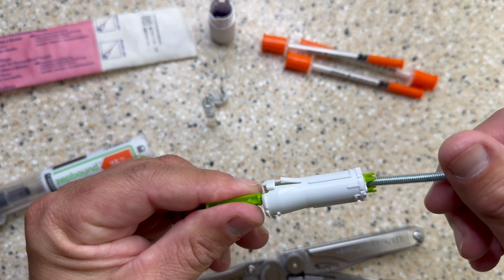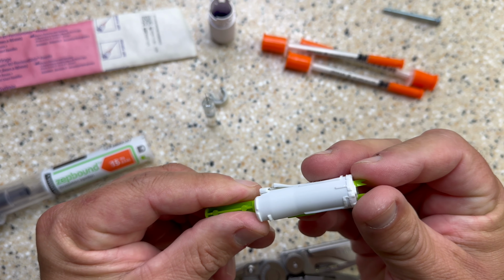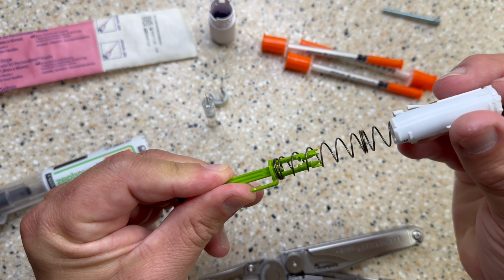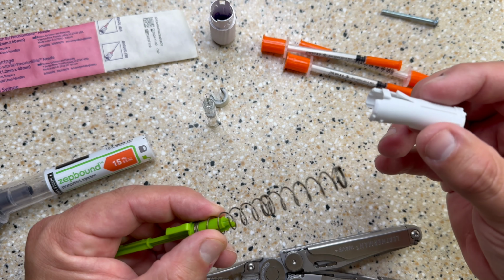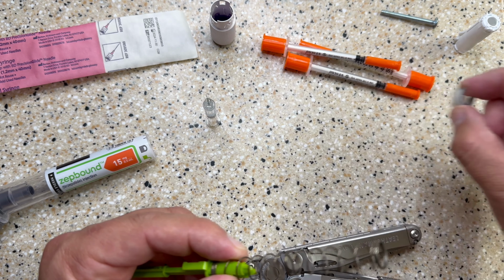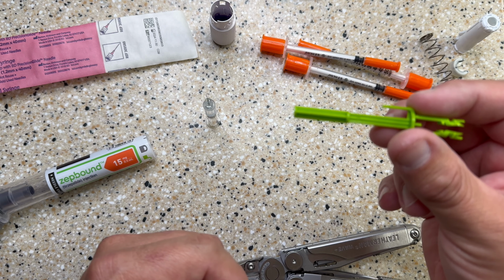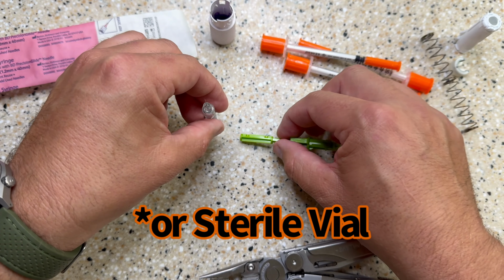I'm just going to show you something a little bit about this. I actually use this plunger in the second part of this process. So what I'm going to do is release it, hold on very tight because this is under a lot of pressure. And that's that. So I throw that in the trash, throw the retainer in the trash, throw the spring in the trash, and then this is what I'm going to use to empty this into the syringe.